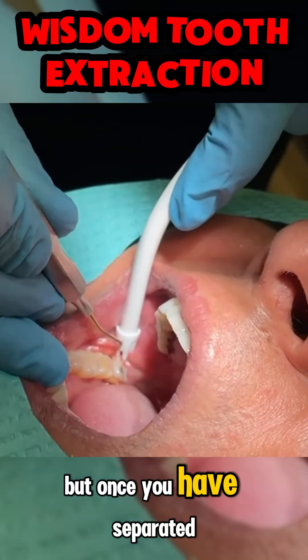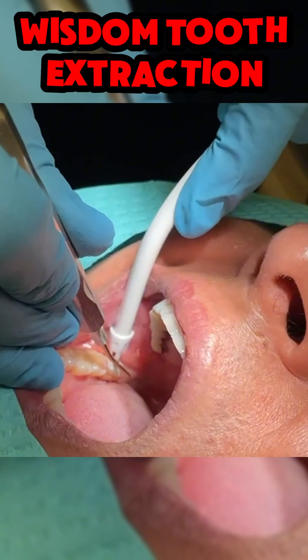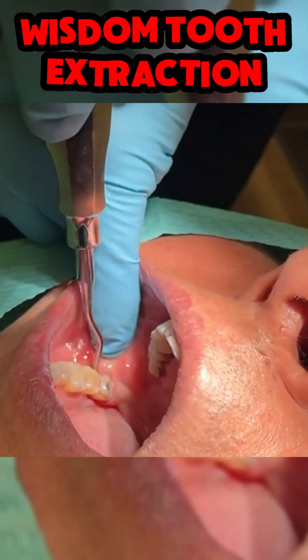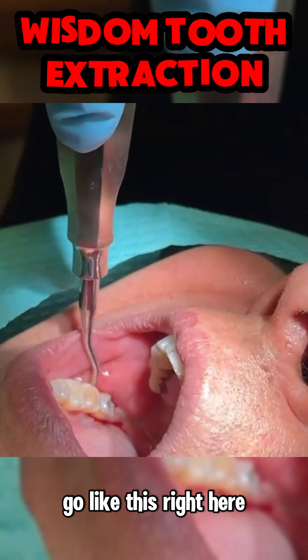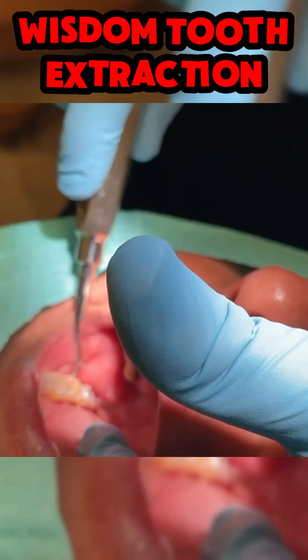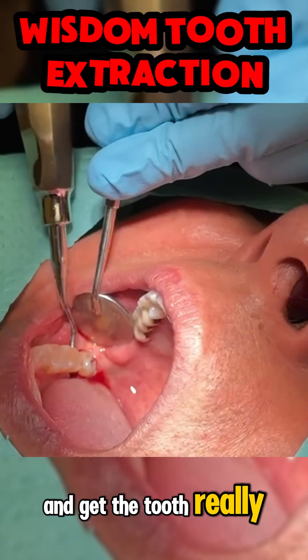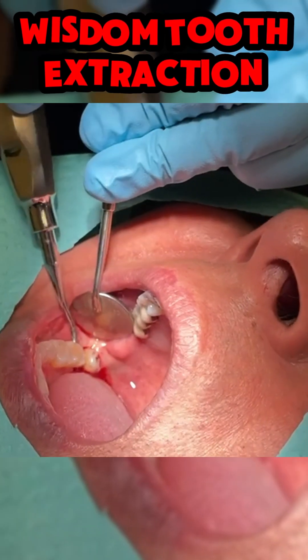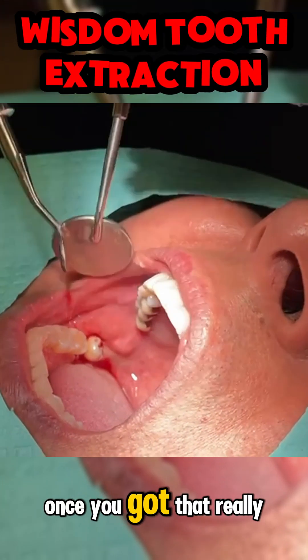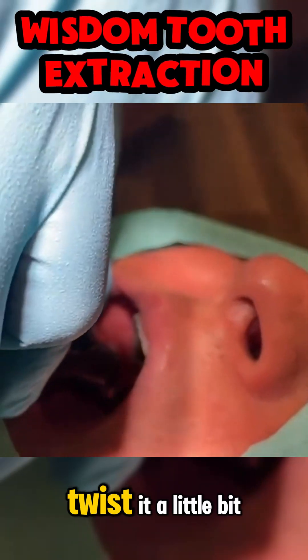Once you have separated the tooth from the surrounding tissue, the tooth starts to become really loose. The elevator is going to loosen the tooth from the bone — go like this. See, this tooth right here is going to get loose right there. Now open — did you see that? Get the tooth really loose with the elevator like this. Once you've got it really loose, you grab it right here and twist it a little bit.